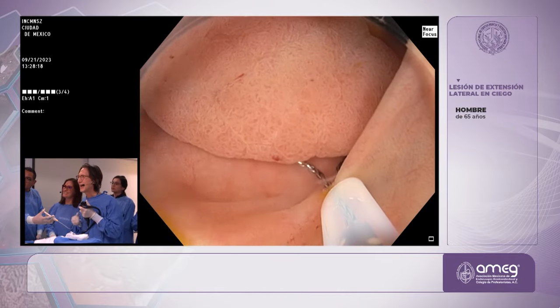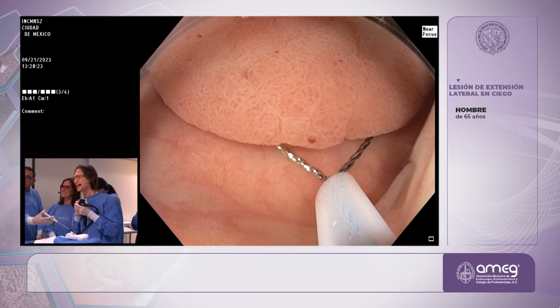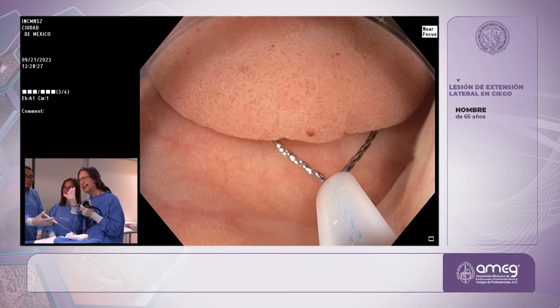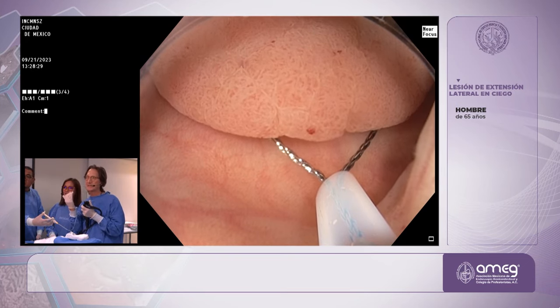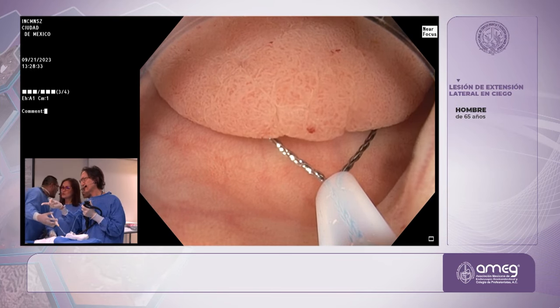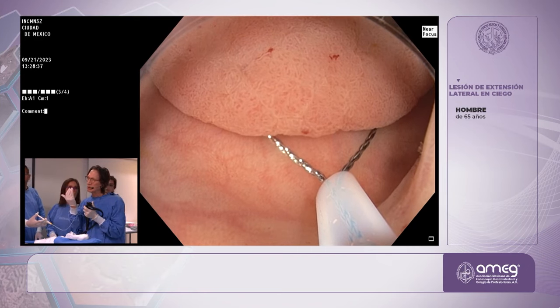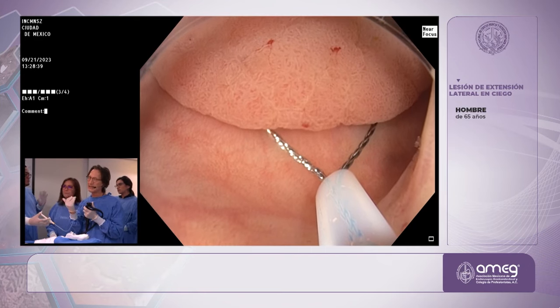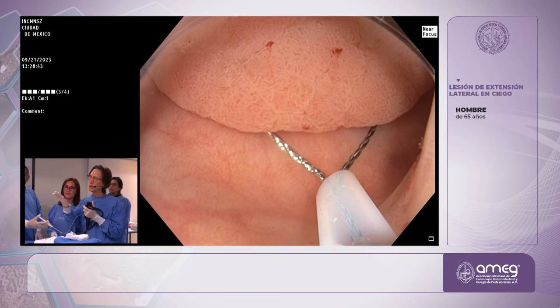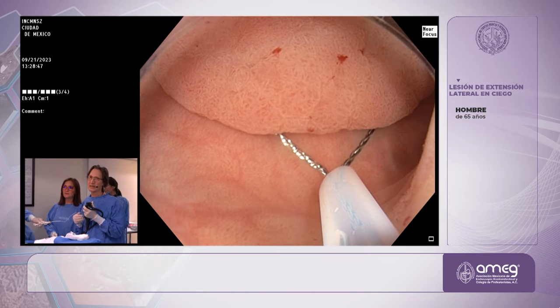Now look, I'm underneath it. And now I want to suck. It's called a water pull. So I'm sucking, and I'm just drawing this very gently in. If this were gas, is the suction working? Sí, la succión. Okay, so I'm doing a water pull. I'm just very slowly pulling some of the water out to decompress. When I decompress, I can pull more of the polyp up into the snare.